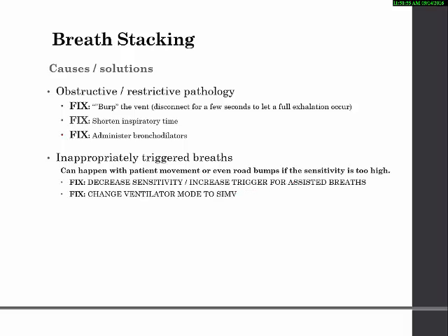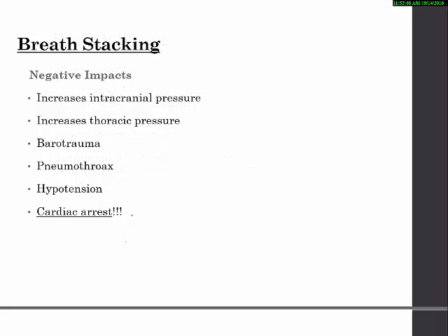So you may need to change your sensitivity on there, and you may also need to change to a different mode if you give medical control to do that. The negative effects of breath stacking are that it increases intracranial pressure, increases your thoracic pressure, and you can cause barotrauma and pneumothorax. So that's not good stuff. Hypotension can occur, and eventually you get cardiac arrest. So we want to fix breath stacking as soon as possible.